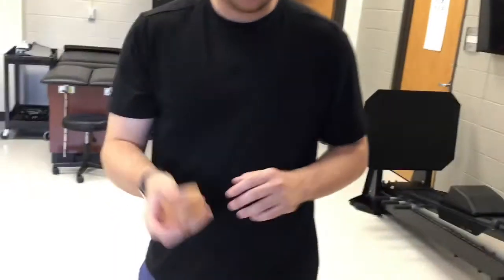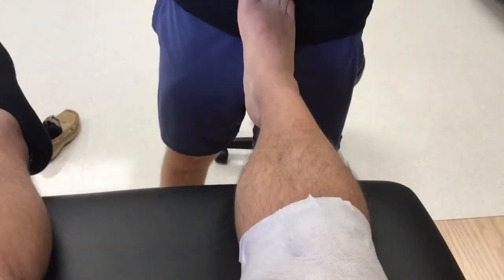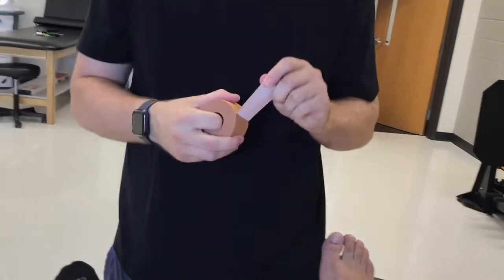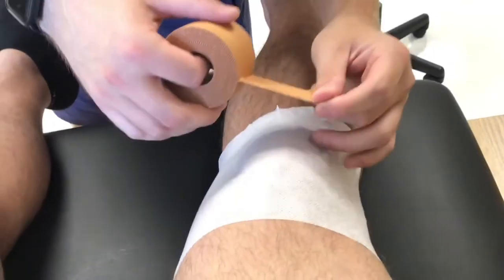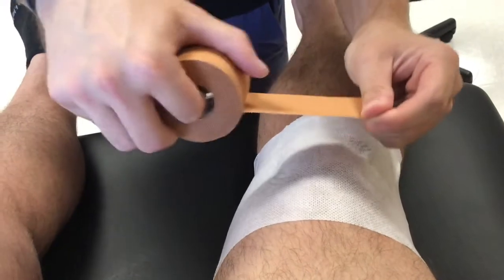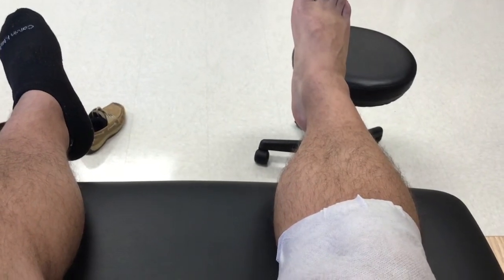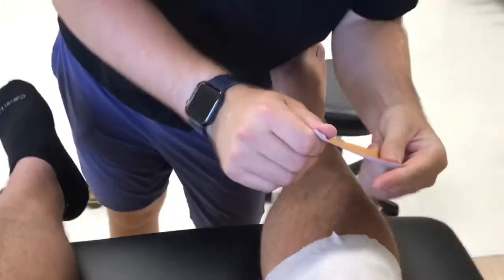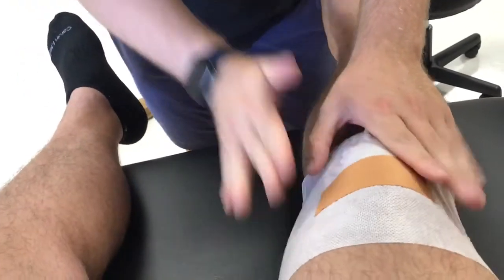We're gonna take Leukotape and we're gonna measure. It'll be 4 strips. And this first strip is going to be stopping any glide that is happening. So this is a glide correction. We're gonna look at the lateral side of the kneecap and pull him medially. So I'm just gonna measure out a nice strip there. Nice tear. And what we'll do is lateral side of the knee, stick it, and then pull him medially.